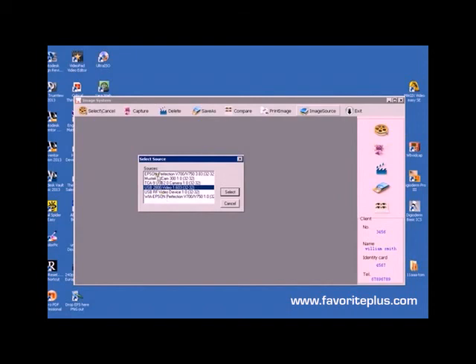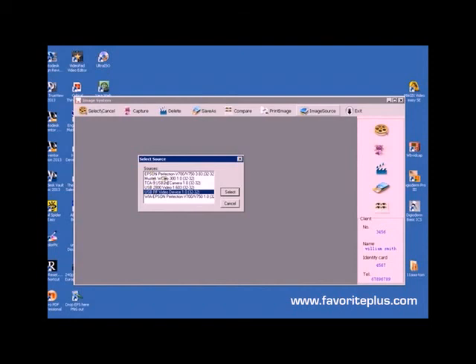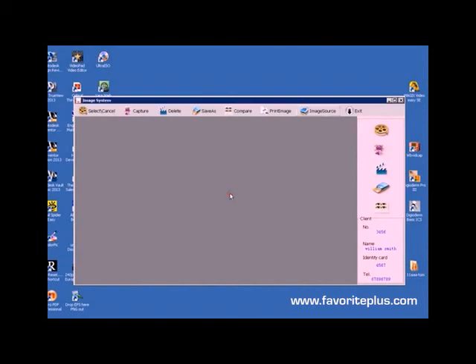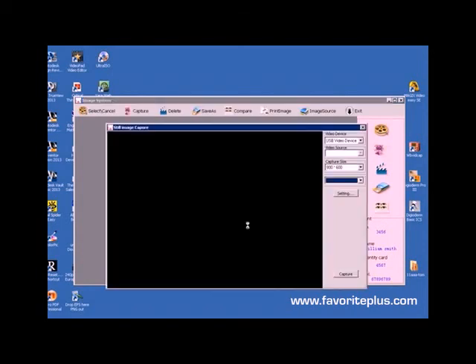This one here is the USB 2800 video which is the wired camera, and this one here is the wireless camera. I've got a couple of others as well. I'm just going to choose the wired camera for now. Click select and then click the capture button, and it brings up this interface here which is the one that gives you the live view of whatever it is that you're looking for.